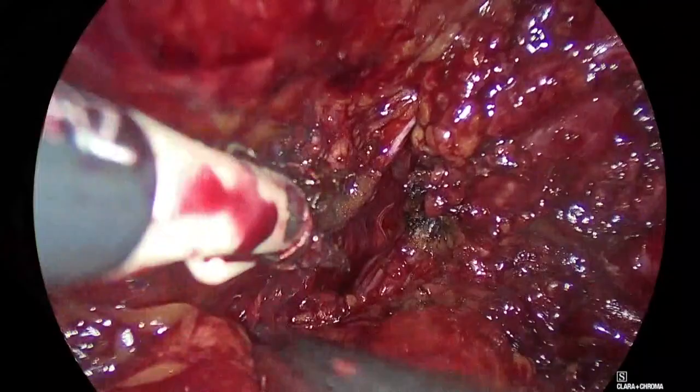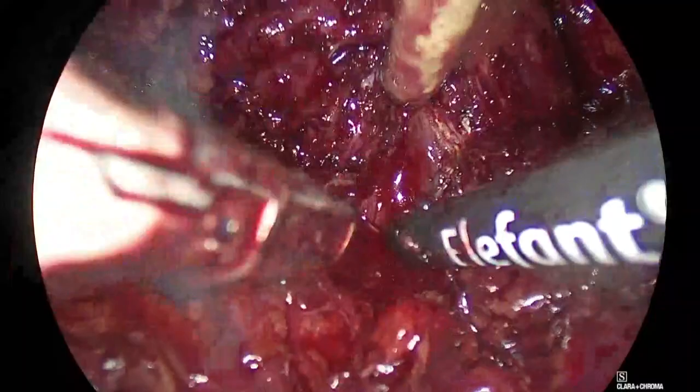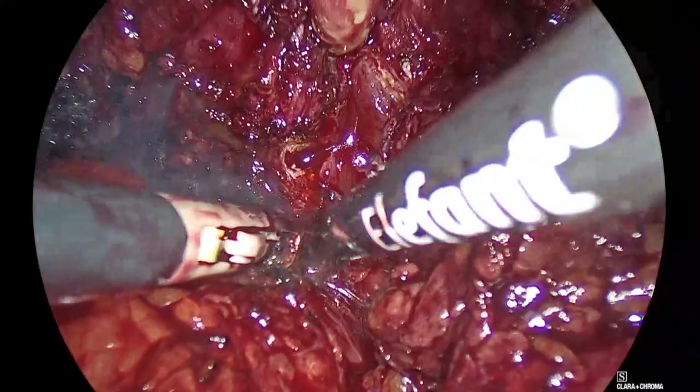This is a problem after mesh surgery. It gets messy. Mess creates mess. Okay, rotate, Padeli. Good. Aspirate, Panagioti, here. Any comments? Please feel free.